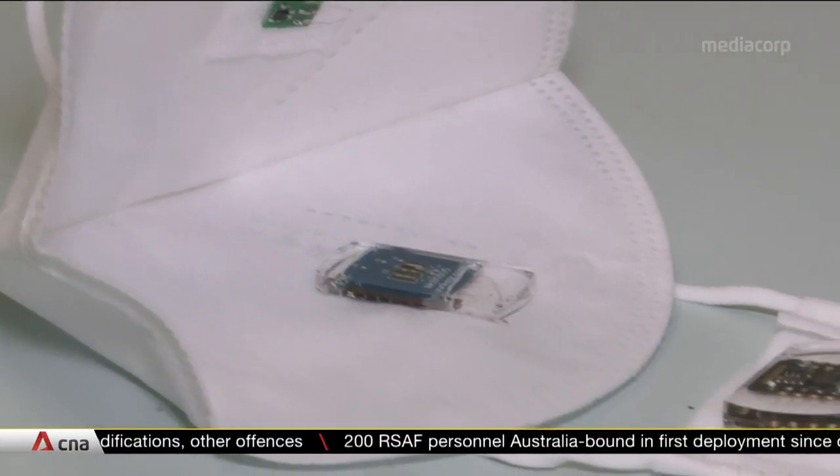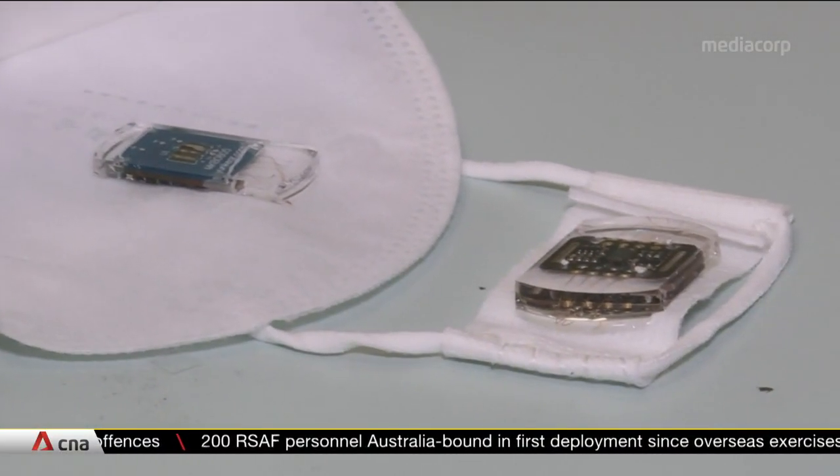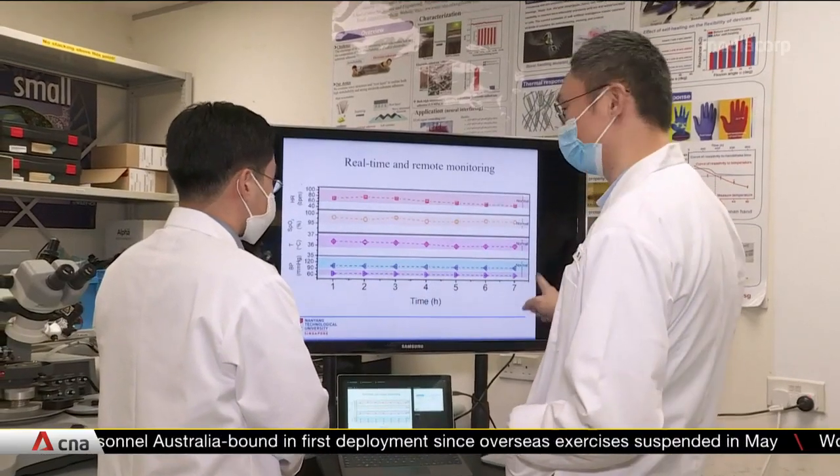The sensors are embedded in an elastic, water-resistant material for comfort. But more work still needs to be done outside the lab.